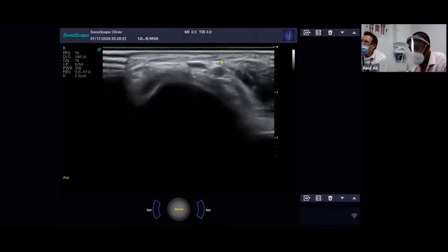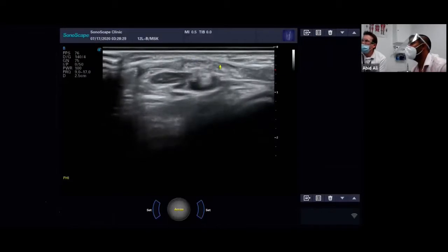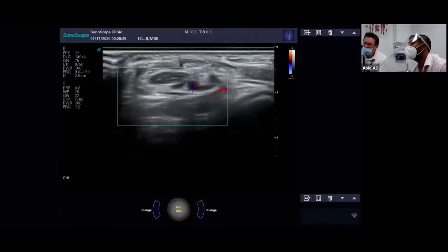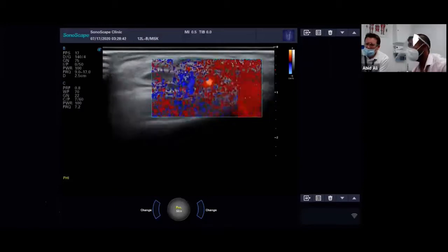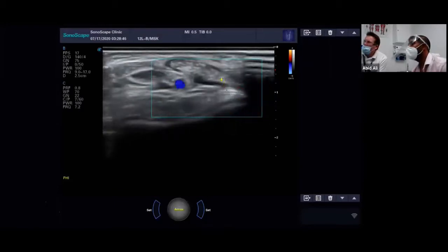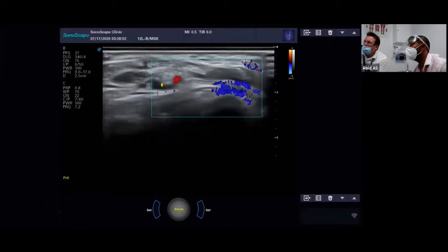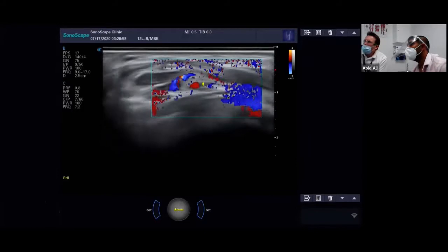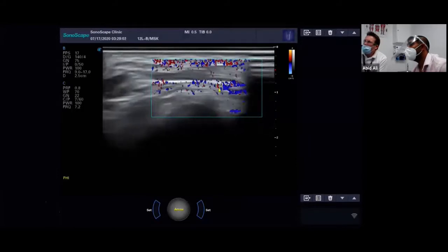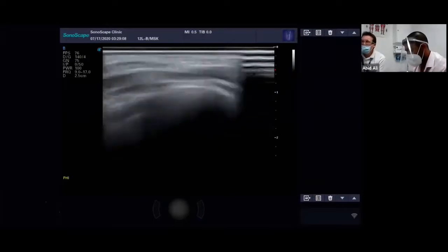Okay, so let's come back up the ankle. And we're back onto that extensor complex. You can see the artery pulsing away there. We'll put some colour flow there, you'll be able to make out the blood flow. And don't forget, we're still in our transverse section. All this is artifactual. So if you move, you will create a lot of artifact. This is real, obviously, here. But any movement will pick up all that artifact. So all this wash down here that's coming in. Not much of anything. Okay, so we've scanned from medial to lateral in transverse.